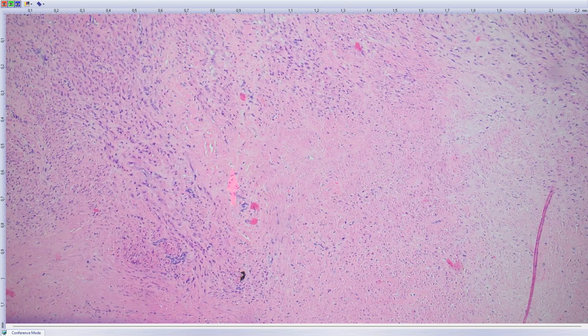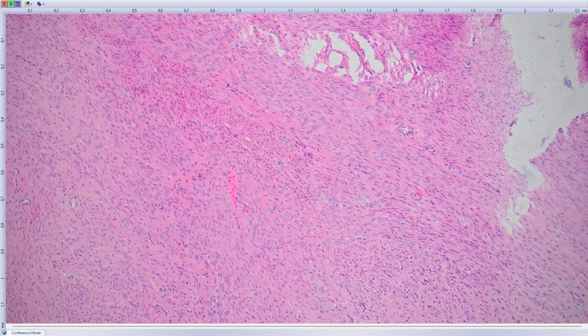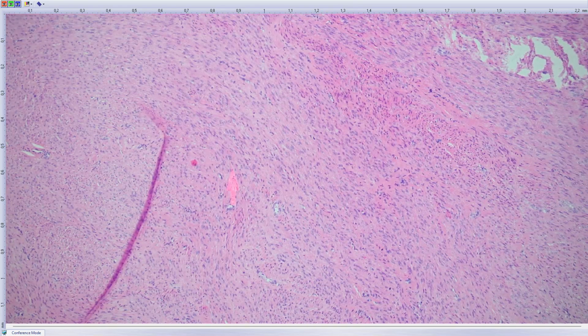So this was a young woman, 34 years old, and also the context was not that worrisome. Apart from some focal atypia, there was no increased mitotic activity. The nodule was well circumscribed. So the only worrisome thing was the necrosis here. There are basically two types of necrosis recognized in uterine tumors. One is ischemic type necrosis, and one is tumor type or coagulative type necrosis.